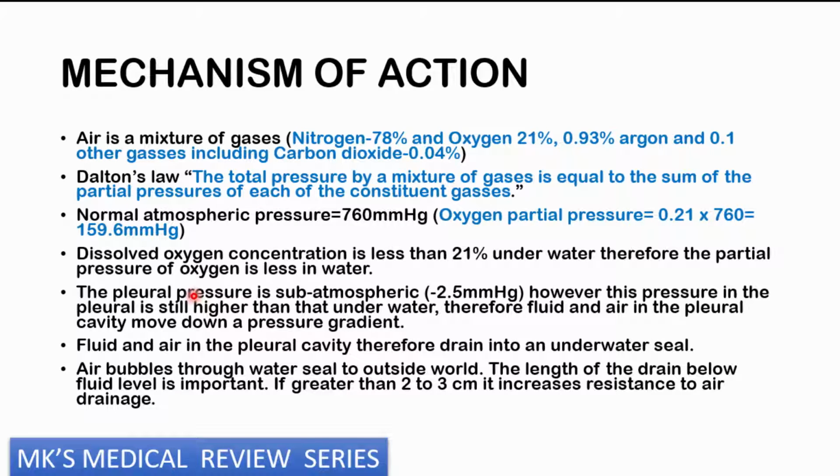When it comes to the mechanism of the ICD, I'll take you back to some of the principles that you learned in chemistry and some of the principles that you learned in physics. So remember that air is going to be a mixture of these gases. It's going to contain nitrogen, at a percentage of 78%, oxygen, at 21%, argon at 0.93%, and other gases at 0.1%, including carbon dioxide, at 0.04%.